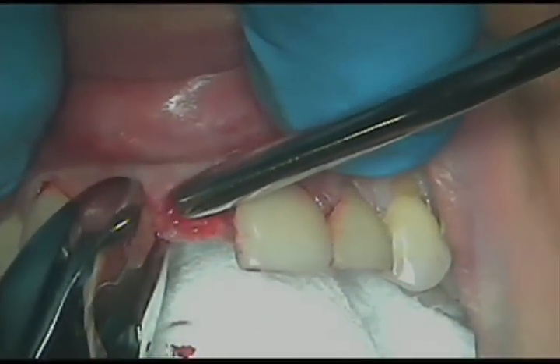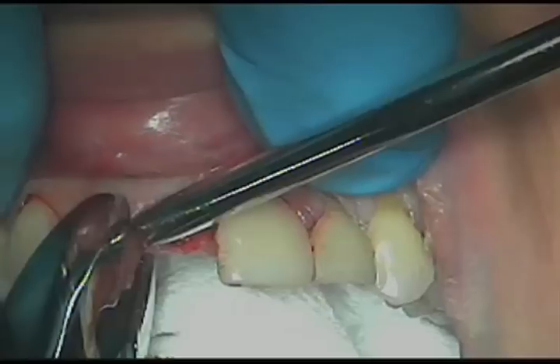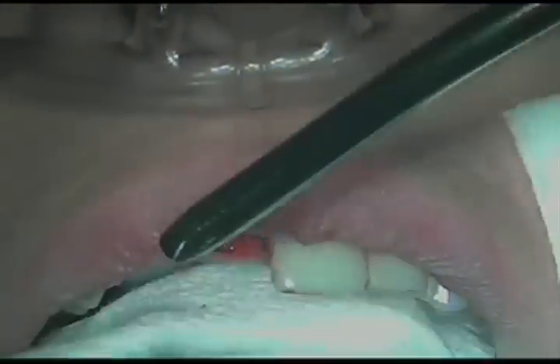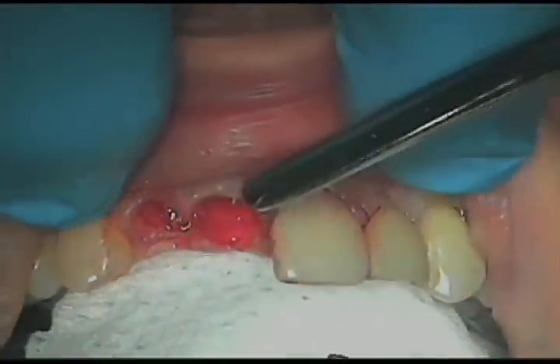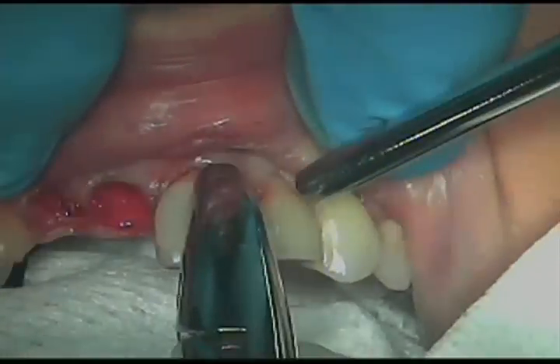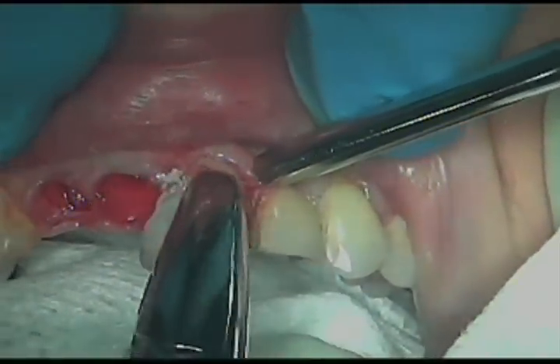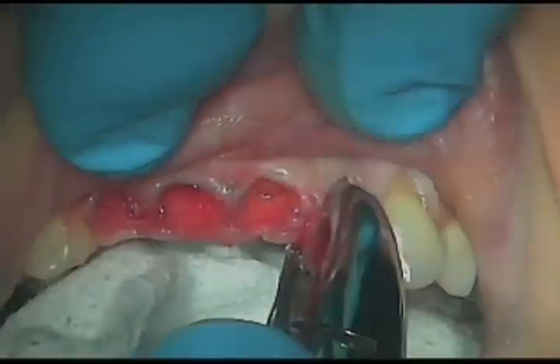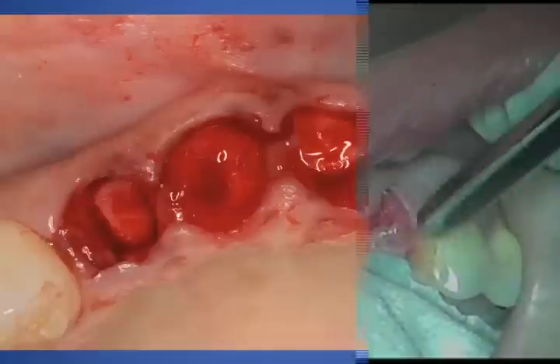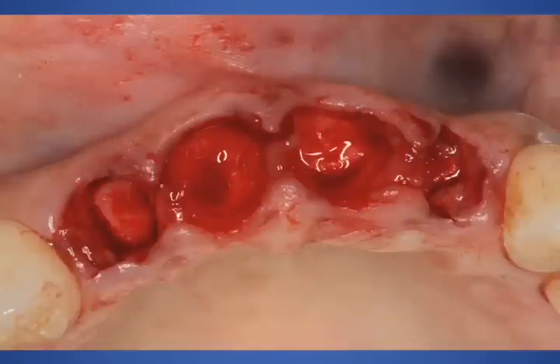We have a nice clean extraction, trying to, again, maintain the interdental papilla as possible. We're simply removing those 4 mobile anterior teeth with the shortened roots, and you can see I'm not having any difficulty at all simply removing these teeth. We will not use a scalpel in this situation. Again, we're trying to maintain that interdental papilla as much as possible to maintain our final aesthetic results. Nice, clean extraction.